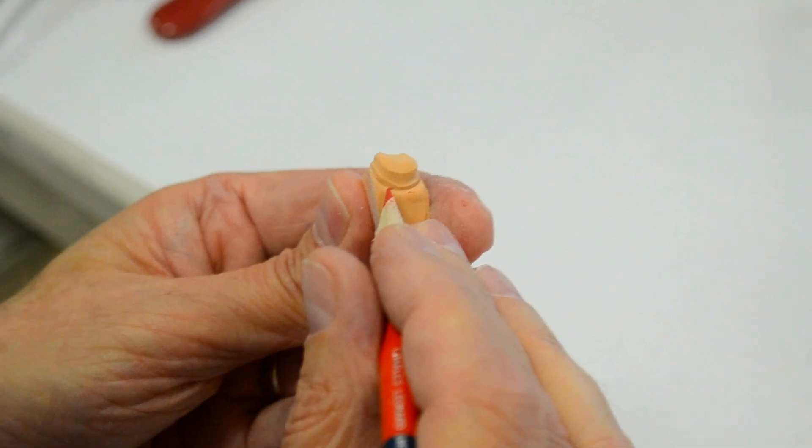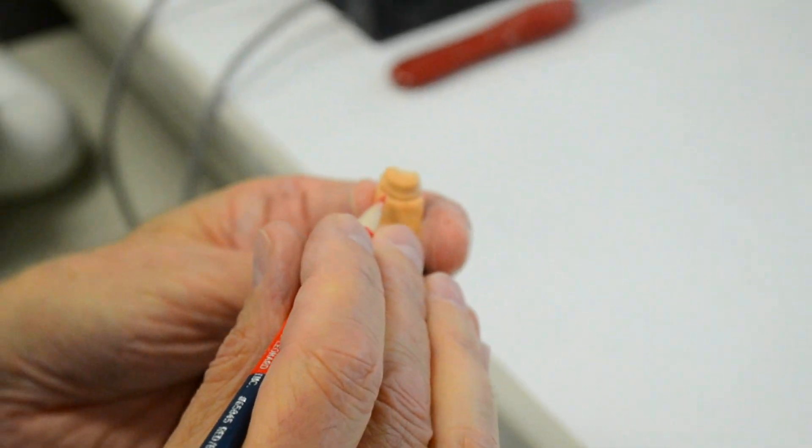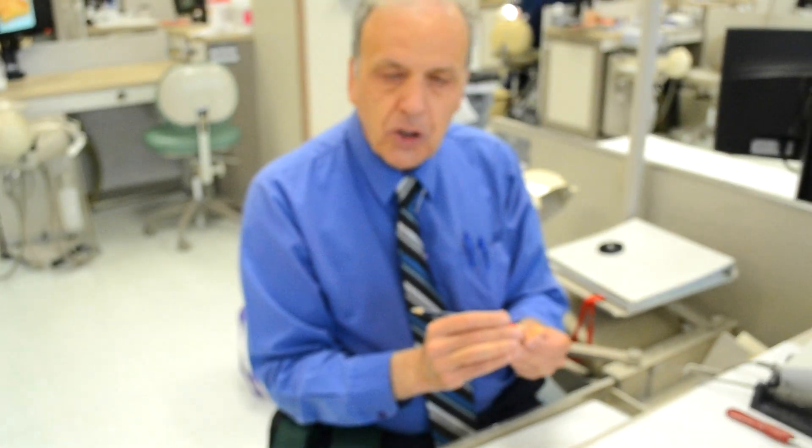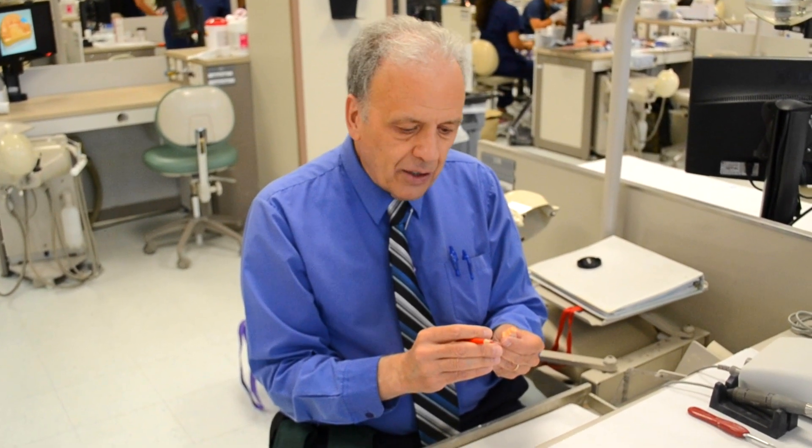So the process called die trimming is really a rather simple process that takes just a few minutes to accomplish. Once performed correctly, as I said before, the finish line on the die will be accessible, and waxing and trimming will be far easier to accomplish. So without any further ado, let's go to die trimming.